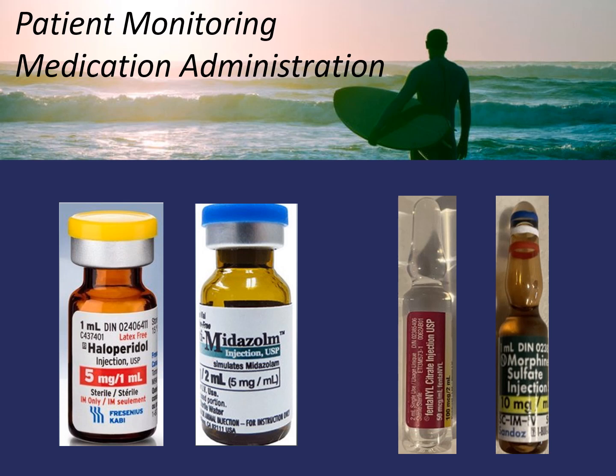Respiratory depression can be caused by oversedation, and this will manifest with abnormally high or low end-tidal CO2 well before pulse oximetry detects a failing oxyhemoglobin saturation, especially in patients receiving supplemental oxygen. This may be tricky to apply to a patient considering the situations we can be using Haldol or midazolam for, but capnography utilization when we're administering antipsychotics, benzodiazepines, and opiates is a consistent monitor of the ABCs. It really just makes life that much easier for us.